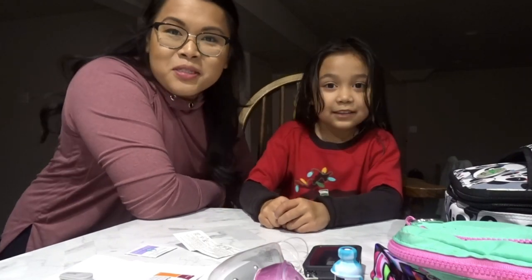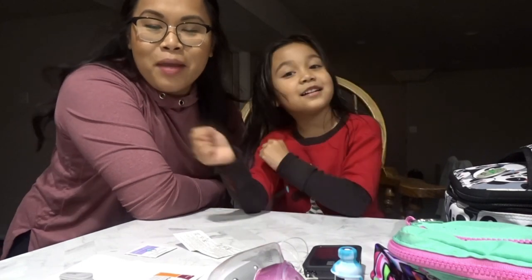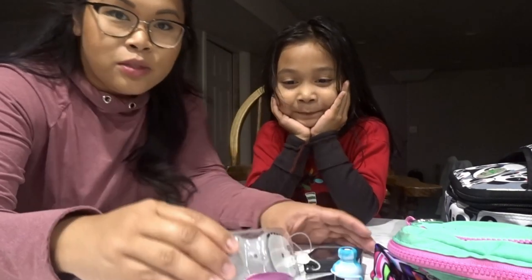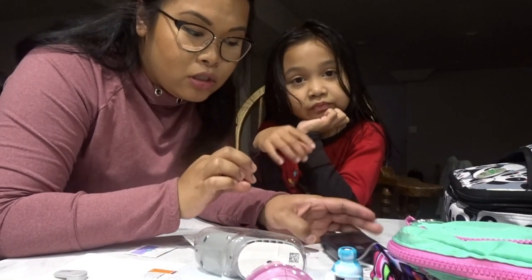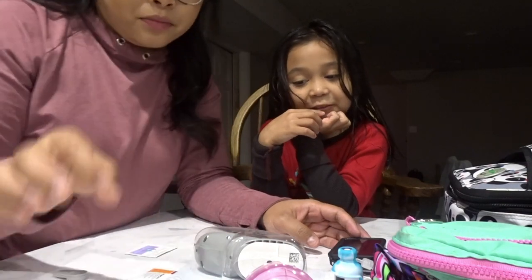Hey, what's up Dose family! Today we have a double site change - we are going to do a Dexcom change and a pump change. She just got out of the shower. What are we doing first - the Dexcom or the pump? Dexcom first, then pump.